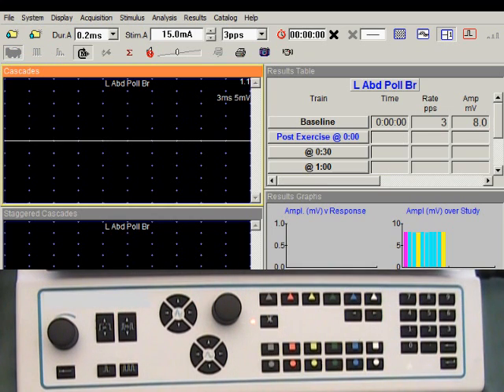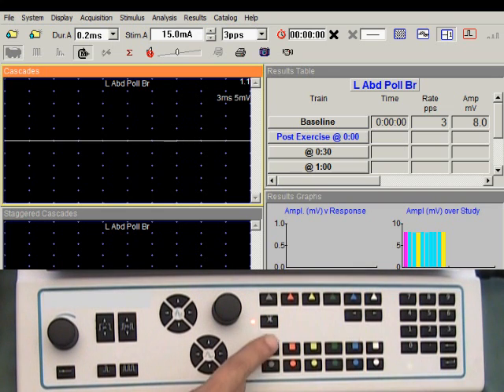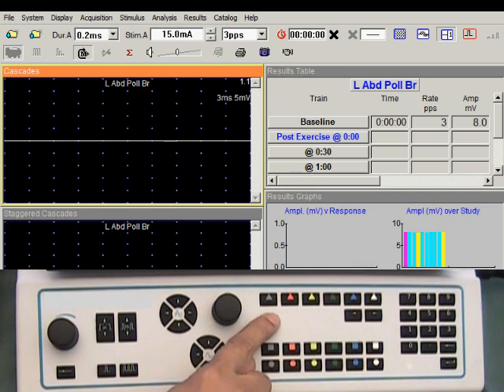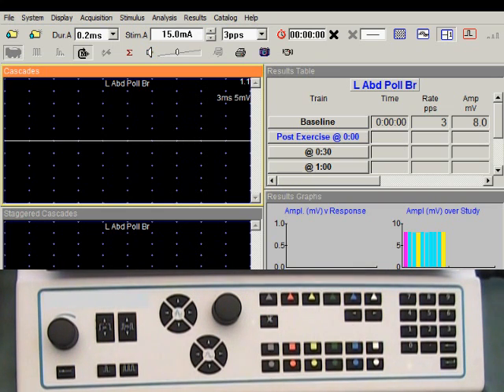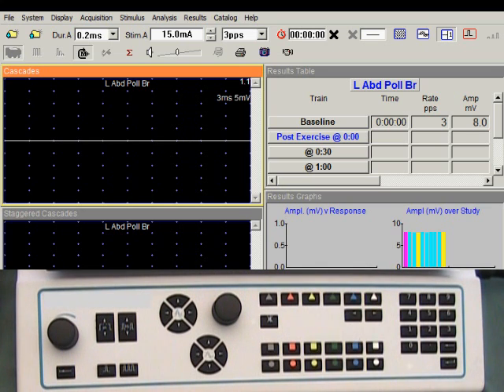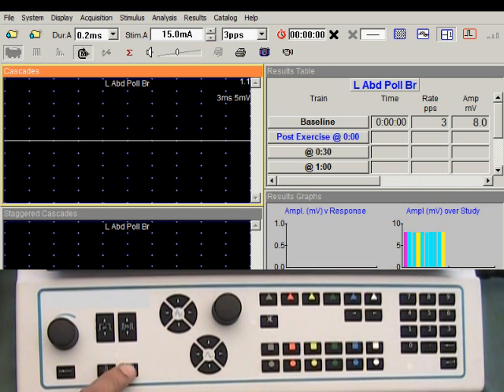I will have the patient contract the muscle, and we can listen to the EMG activity by unmuting the audio. Let's say the necessary exercise is done. Relax and deliver a train of stimuli.